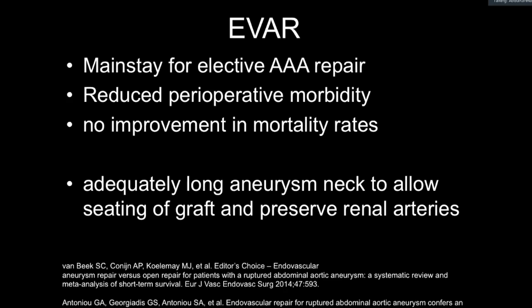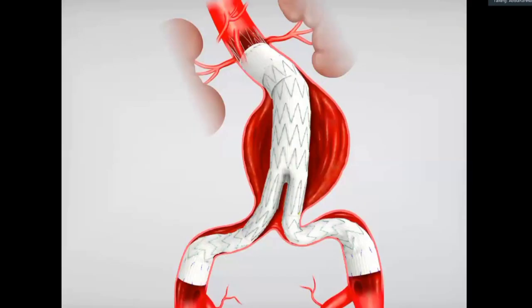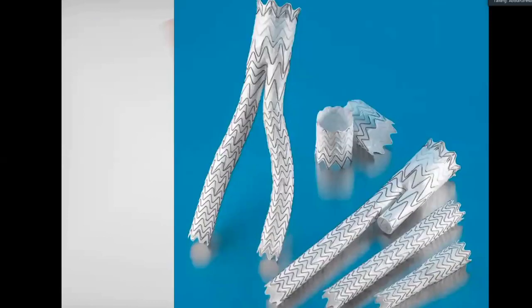Endovascular aortic repair is now being offered both in the elective and emergency setting. I'm going to skip this in the interest of time. This is what an EVAR stent graft looks like. You will probably not be asked in your exam in Pakistan, but certainly in the FRCR exam, you will have to have some kind of basic knowledge of EVARs.